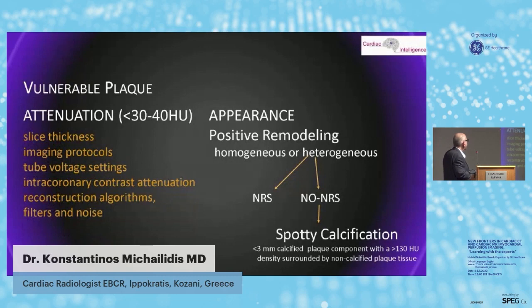Here I have to stress that regarding the attenuation, a lot of things change according to the technique. If you acquire very thin slices, or depending on the tube voltage or the contrast that you achieve, things might change. The attenuation characteristics of the plaques are not so reproducible.